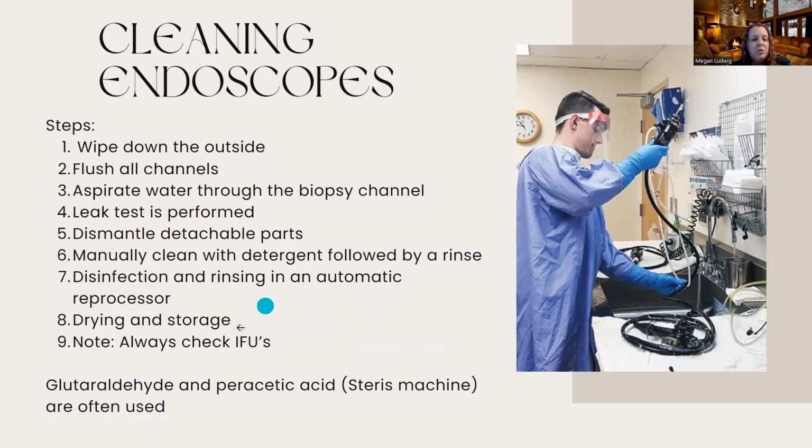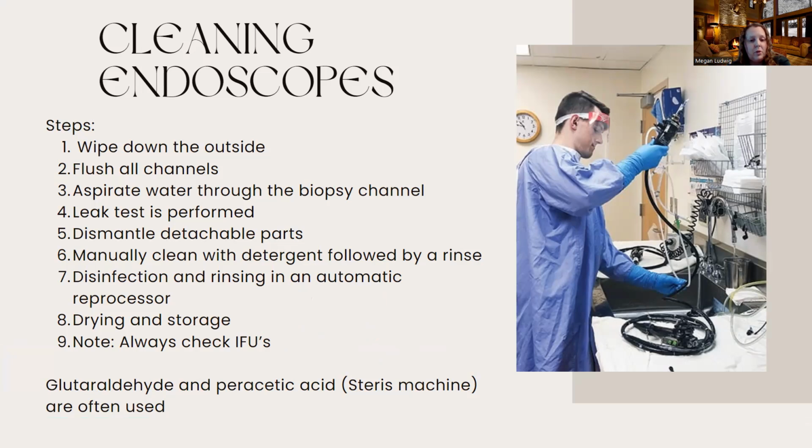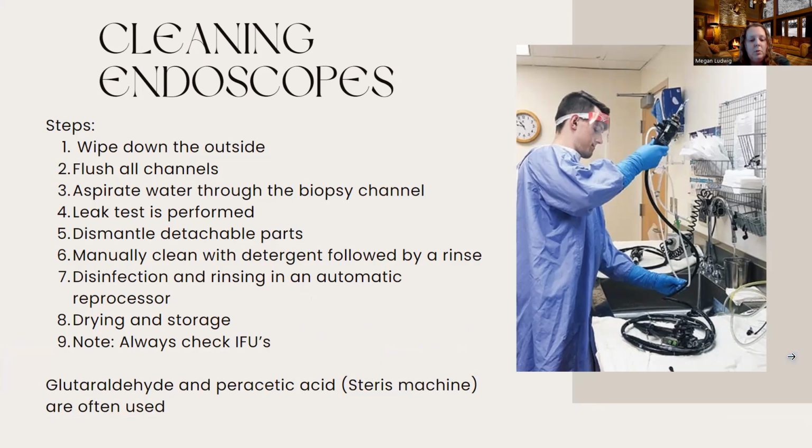And then always check your IFUs for sure, because some scopes or some facilities use glutaraldehyde and some use peracetic acid through the Steris machine. Those are probably the two most common, I believe. Your facility will probably use one of those two.